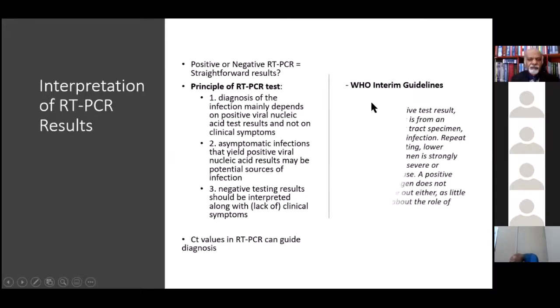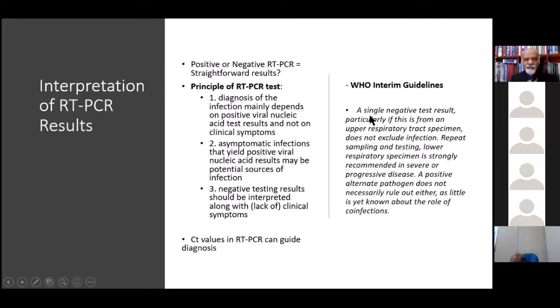So the WHO interim guidelines has a very clear statement here, right, regarding negative test result. So we have to be cautious when interpreting negative test results.